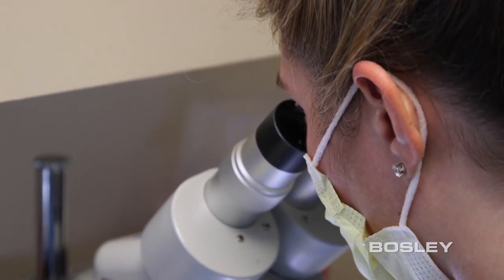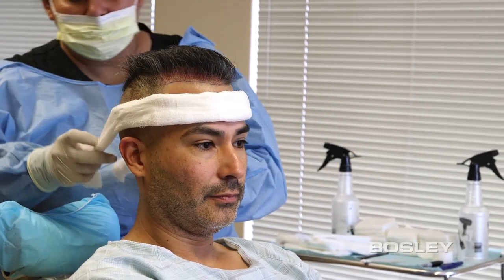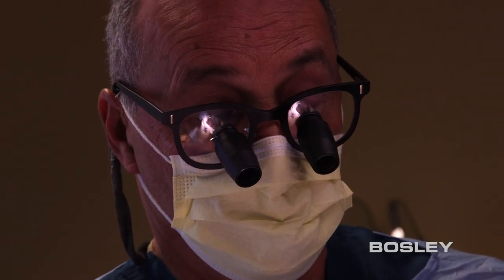While the follicles are being prepared by our team of technicians, we'll begin preparing you for the transplant process. The doctor will begin by creating a natural hairline, by making tiny recipient sites for each new graft to take root.